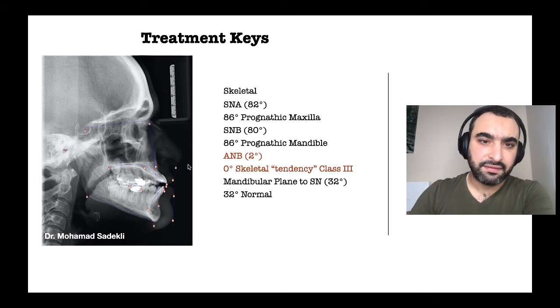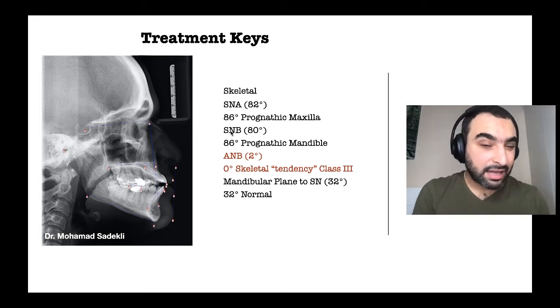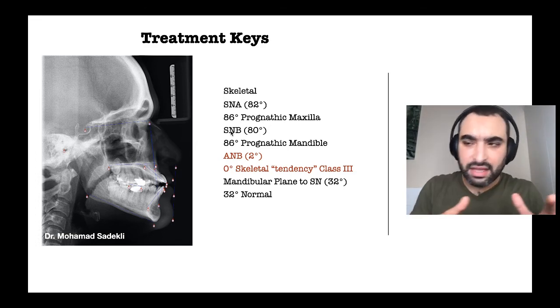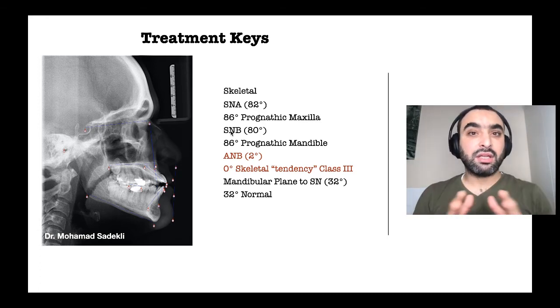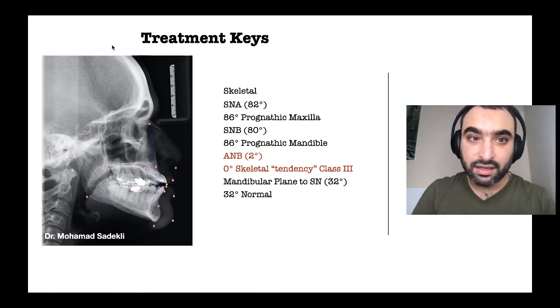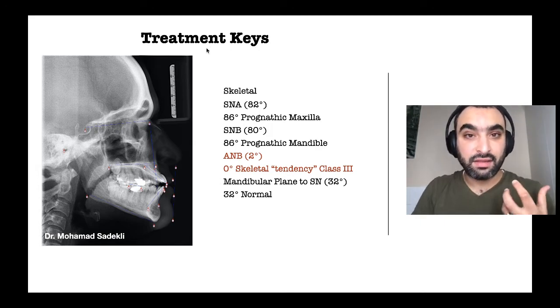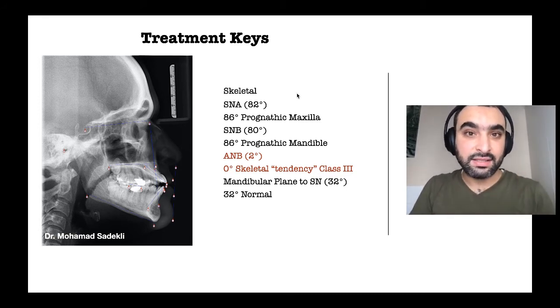Here, lateral ceph. In this case, actually, I will share this case with you not as a classic case presentation with all the cephalometric analysis and like this. Actually, in this case, I just want to share with you how I found the treatment keys for the cases that I usually treat in this way. This case had some treatment keys that I found when I did a good diagnosis for the case, so I treated it in a short time and in a really easy way.